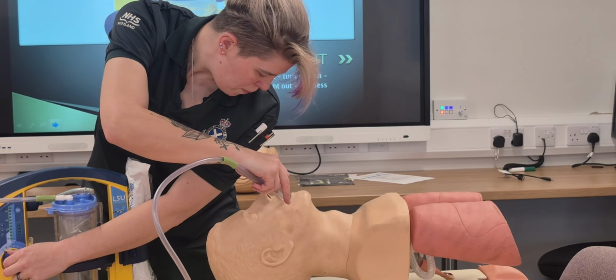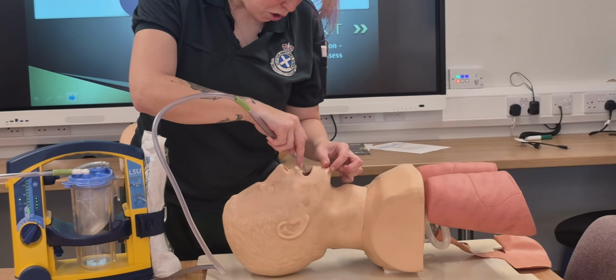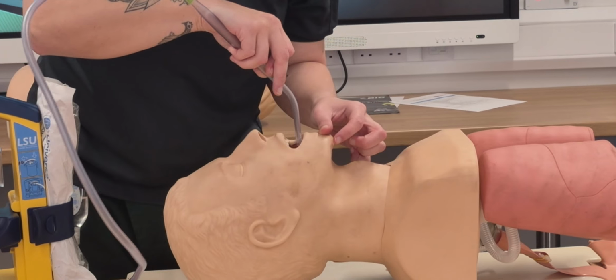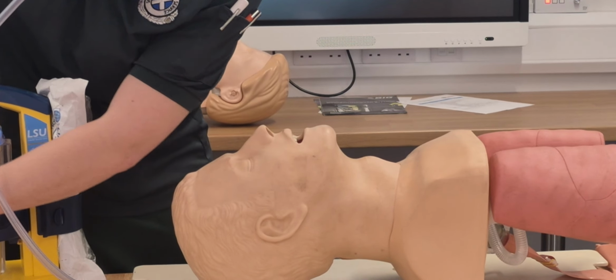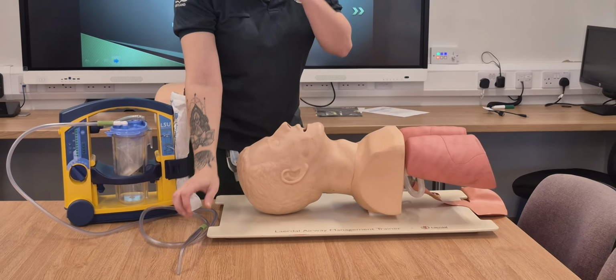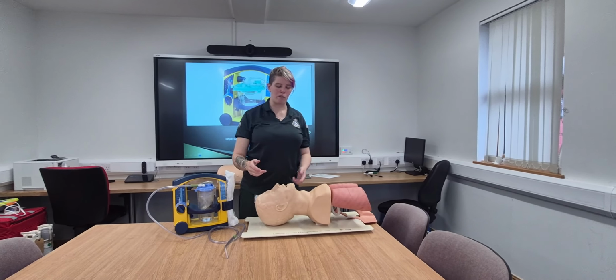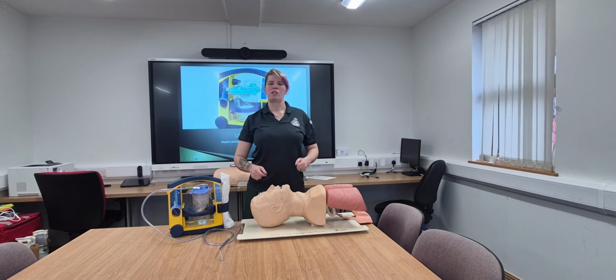I'm going to turn it on, and then I'm going to suction outwards in a figure of 8 motion. Suction out, once I'm all the way out, then I'm going to turn it off. And of course, because we've done something with an airway, every time we do something with an airway, we reassess to make sure that we've been successful. So reassess, that airway is now clear.